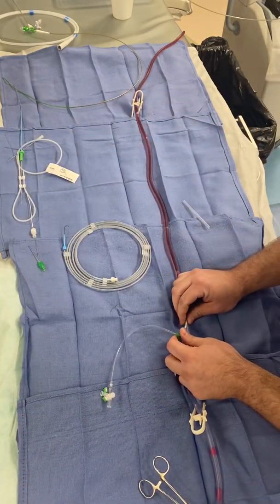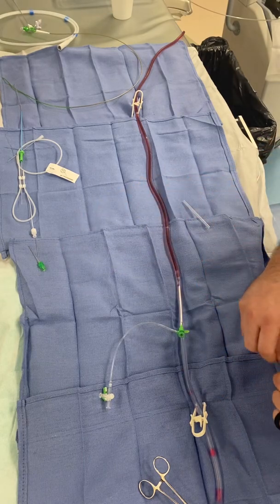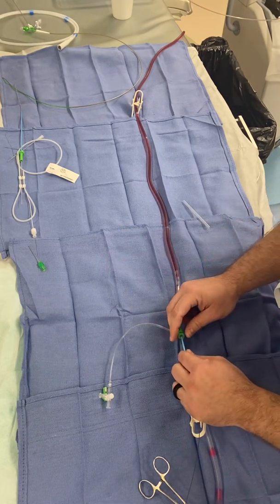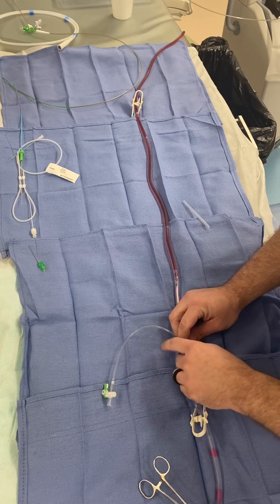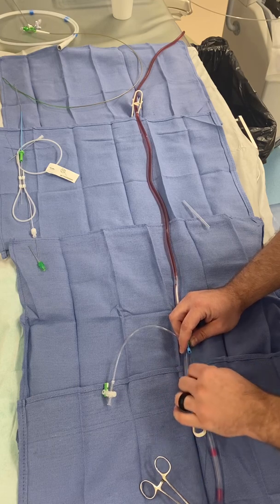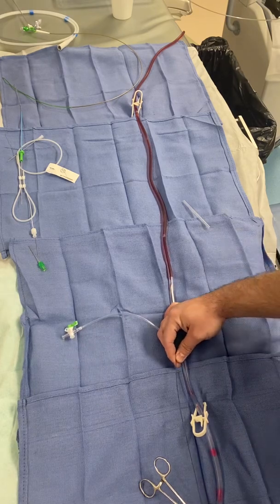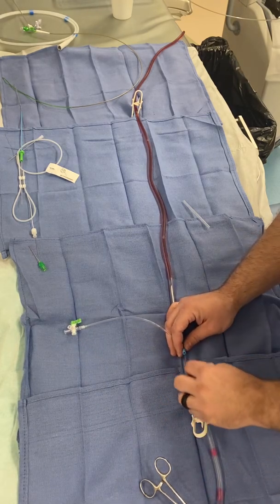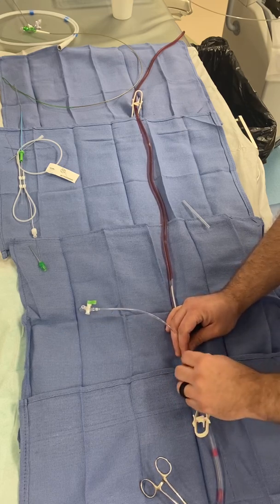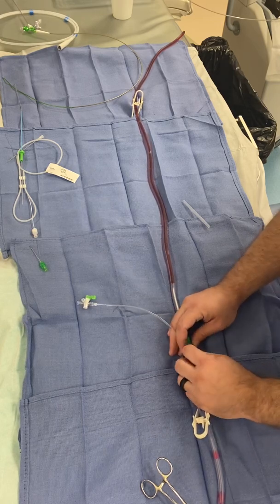I have a regular exchange-length J-wire that I'm going to use. This is an over-the-wire AngioJet catheter and the wire will be passing through my clot. The catheters are over-the-wire — most of them are. The coronary one will be monorail, which is rapid exchange.